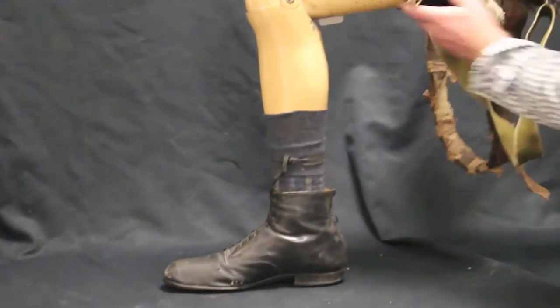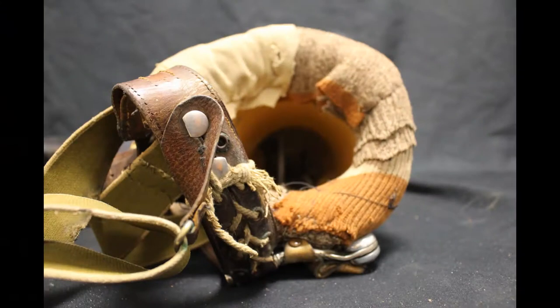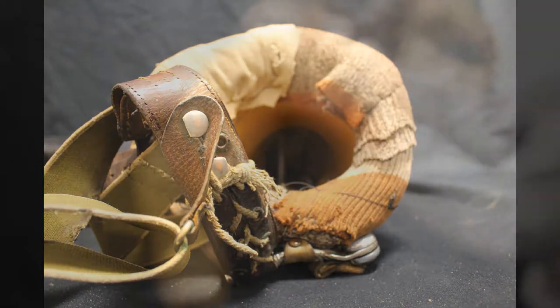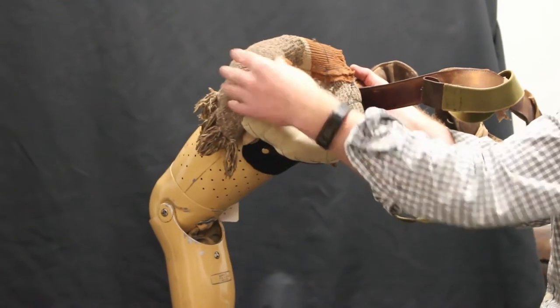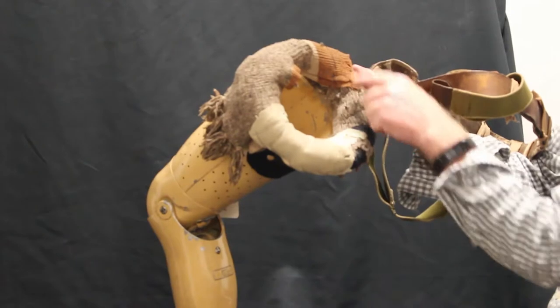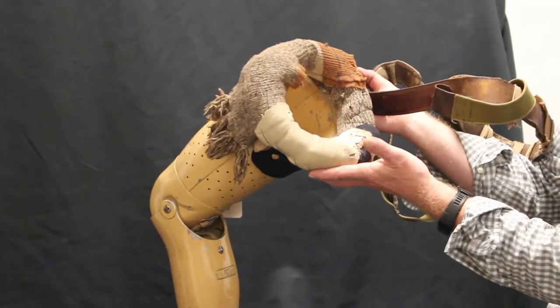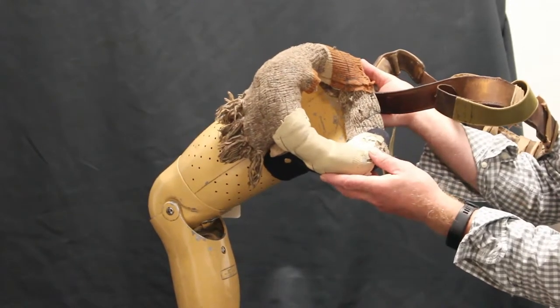Interesting with this limb as well is the customisation which has gone on by the patient with scarves and various pieces of cloth wrapped around over time with loose stitching to aid some form of comfort. But the limb does look as if it has been quite well worn by the user.